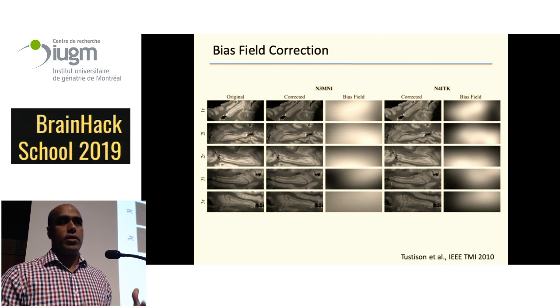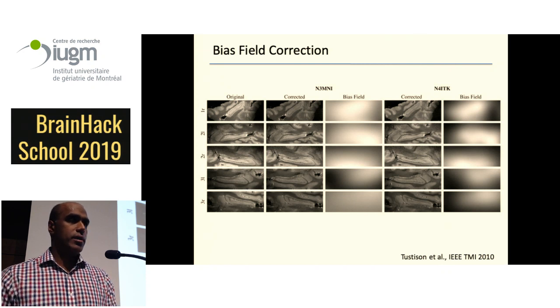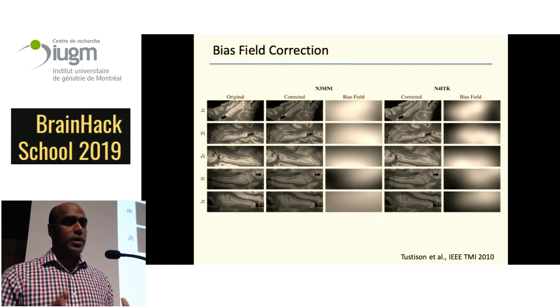We then ran that data through CIVET, which is a cortical thickness pipeline that relies on gray-white matter contrast to drive the cortical thickness estimation. We were also very strict with how we did things, but nonetheless, I would highly recommend this.